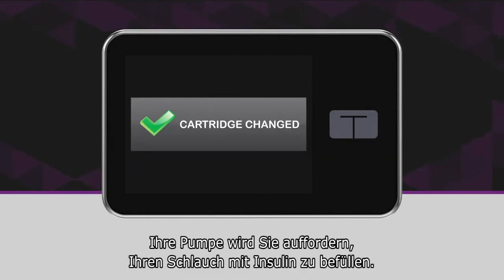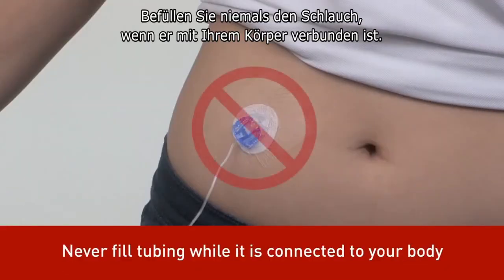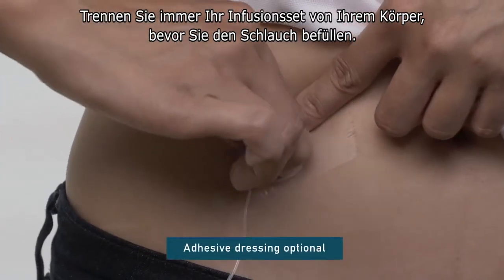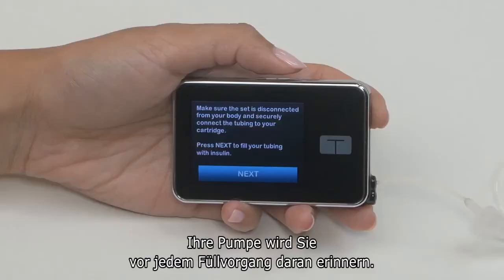Your pump will prompt you to fill your tubing with insulin. Never ever fill your tubing when it's connected to your body — this could result in the unintended delivery of insulin. Always disconnect your infusion set from your body before you begin a load sequence. Your pump will remind you of this each time you tap Load.